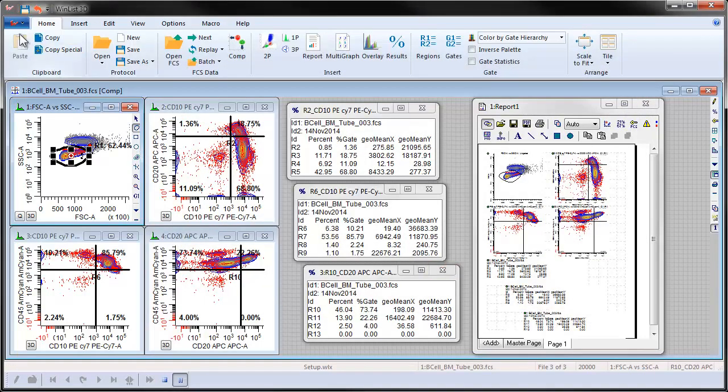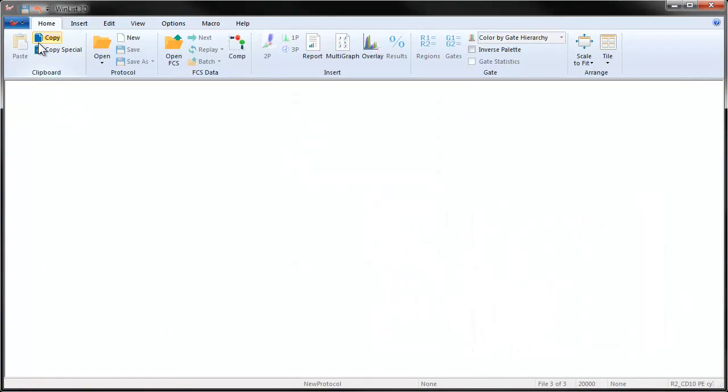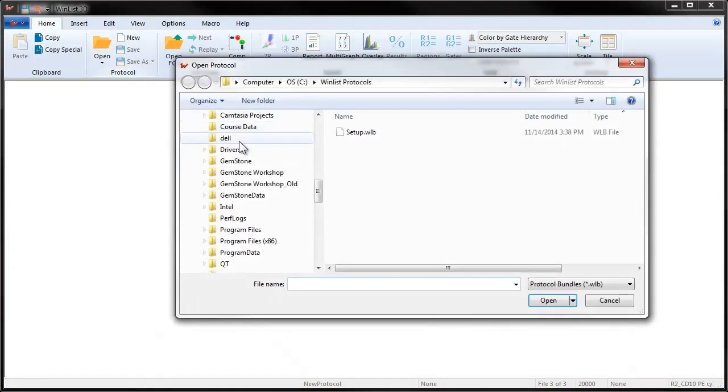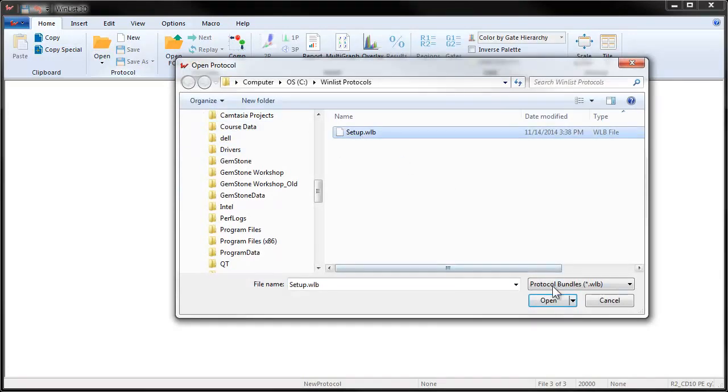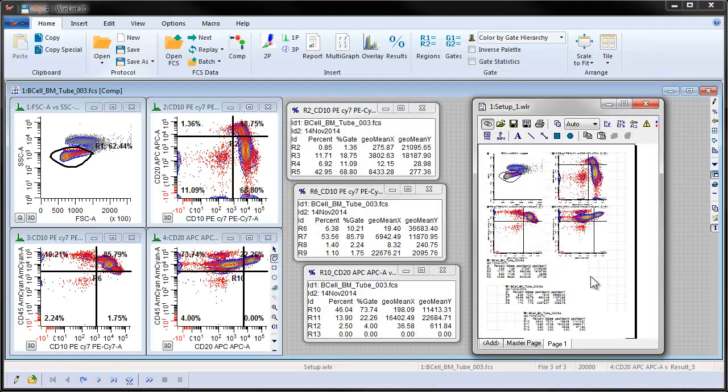With a protocol or a protocol bundle, when you open WinList and see the workspace, you can choose a protocol and completely recreate your entire analysis setup with just one click, ready for the next set of files.